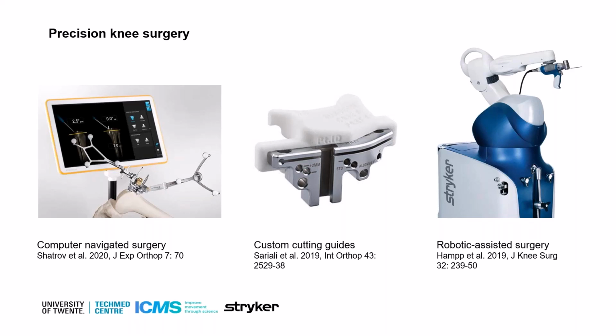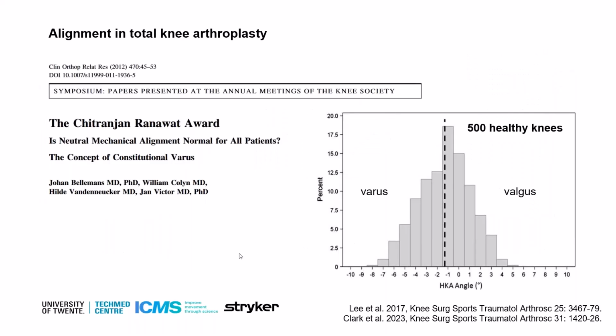But apart from precisely cutting the bones or achieving the desired placement of the knee implant, there remains to determine the target of these versatile instruments that will also lead to clinical improvement. Traditionally, the knee implants are placed according to mechanical alignment principles because it is a technique that could be performed with traditional imaging and conventional surgical instruments, ultimately striving for a straight leg. We discussed that in a previous webcast.